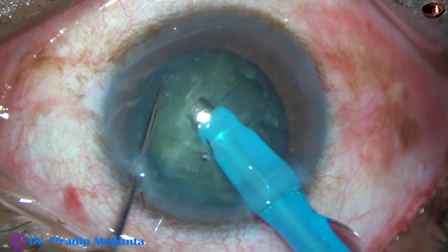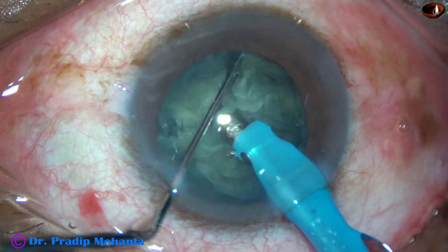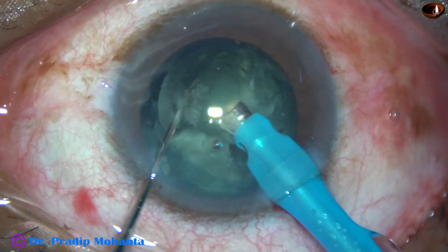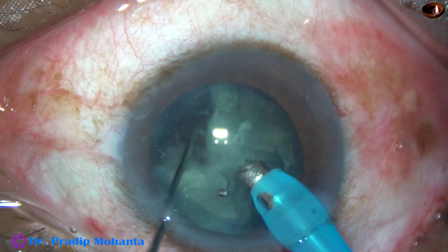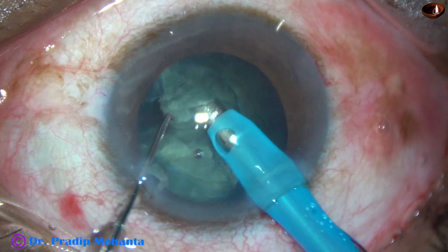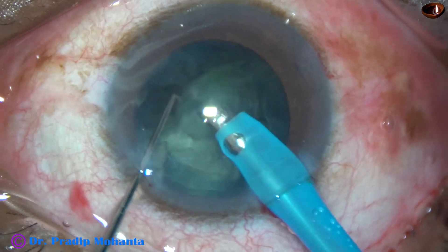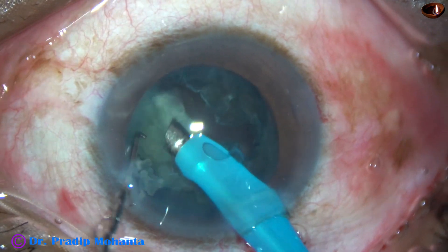The nucleus is held firmly with vacuum and it is chopped. Now the nuclear fragments are emulsified with ultrasonic energy, which is 60% in this case. Flow rate is 45 ml per minute and vacuum is 450 mmHg.